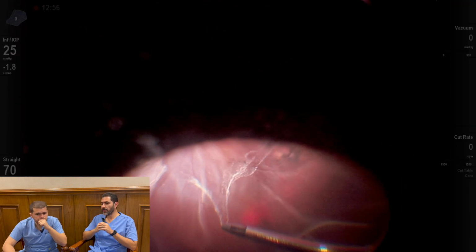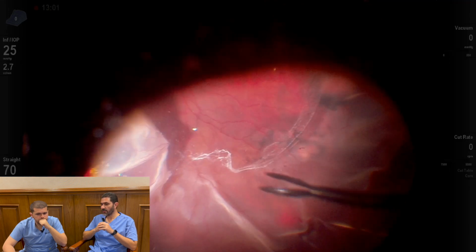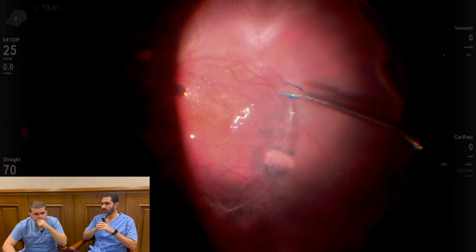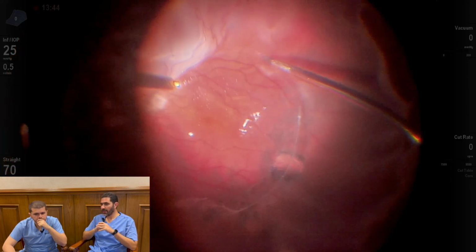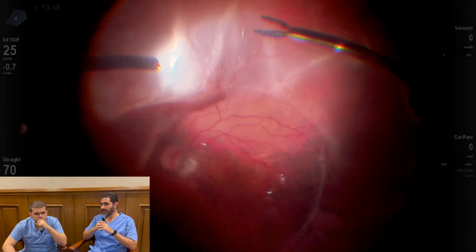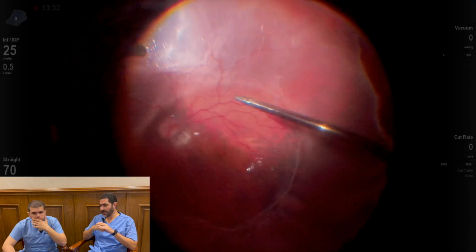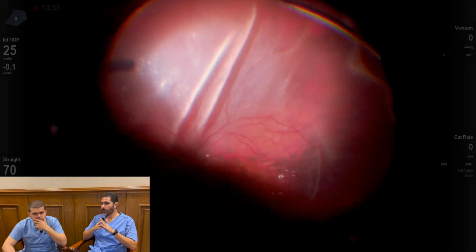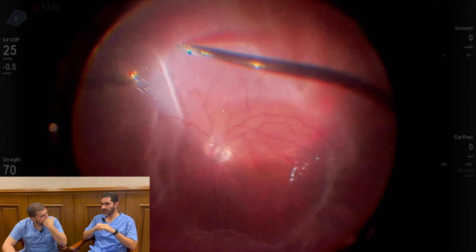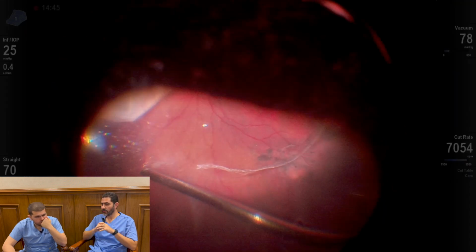Sometimes you may tend to use it, or it's a must to use this kind of dissection, where you peel the membrane and pull it in two different directions. It is not the common way to detach the hyaloid, but if it's mandatory, as in this case, because this is a very anterior attachment for the hyaloid and you cannot leave it in this area. So if you cannot propagate the wave and you remove at least the posterior pole hyaloid, yes, I may resort to bimanual and start to peel the membrane in different opposing directions.